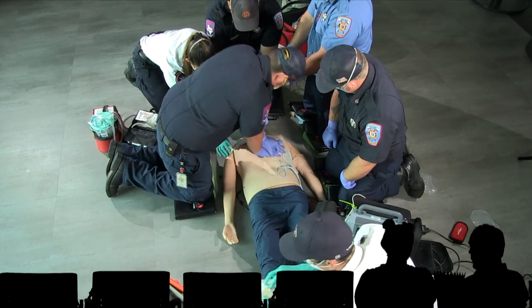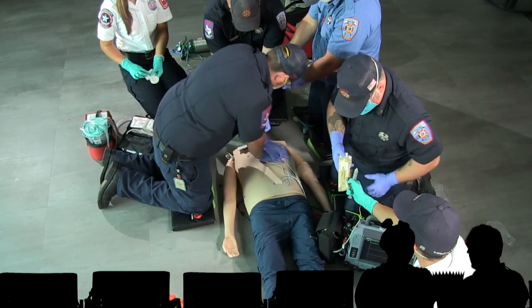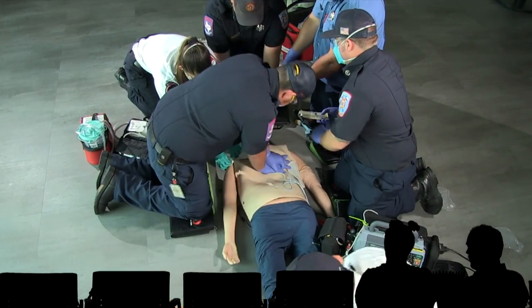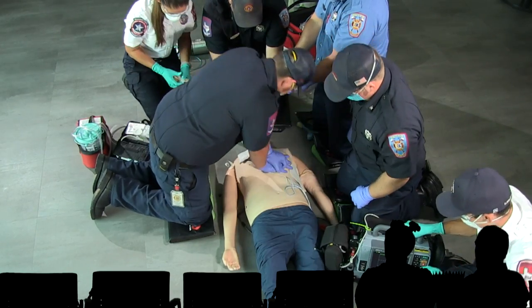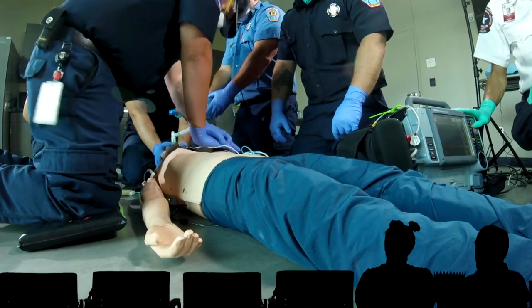Rumor has it that the only thing we really know about epinephrine, in addition to getting pulses back, is that you've got to get it in quickly. Yeah, I've heard that. So there goes that life-saving epinephrine. We've got the monitor there. We've got two-handed seal.